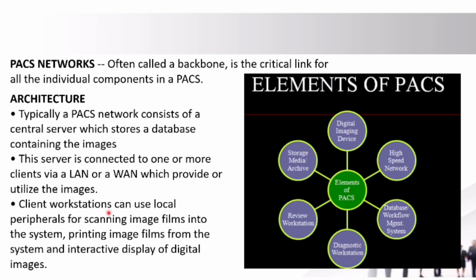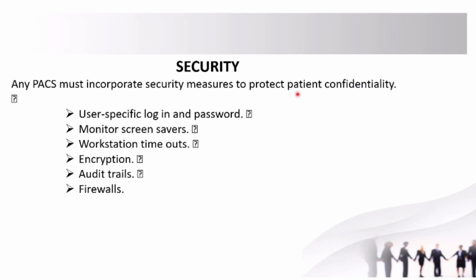Client workstations can use local peripherals for scanning image films into the system, printing image films from the system, and interactive display of digital images. So these are the elements of the PACS. We have digital imaging devices, high speed network, database workflow, diagnostic workstation, review workstation, storage media, and archive.